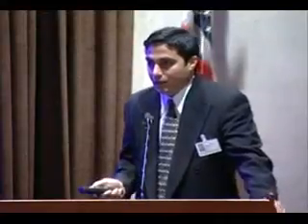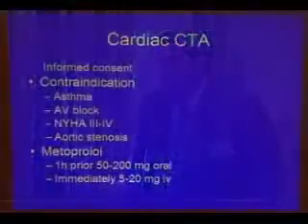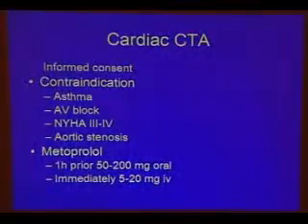Now, what entails performing the procedure? Well, first of all, we explain the procedure to the patient. We obtain informed consent. There is very little risk to this procedure, and again, I emphasize the word non-invasive. The procedure entails injecting intravenous contrast, and all you're going to feel is a little pinprick of the needle going in your vein where the contrast will be injected. After that, there's no pain involved.